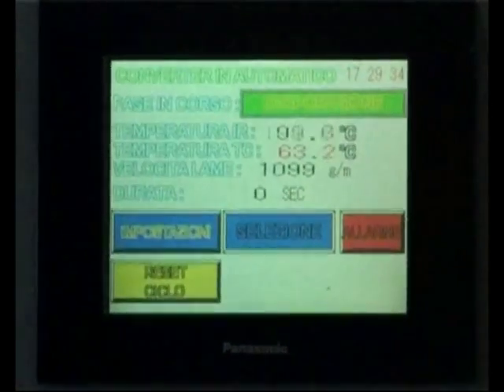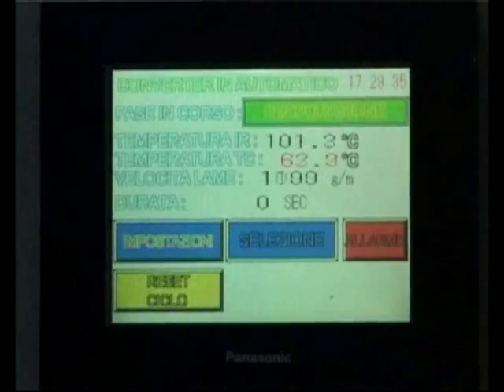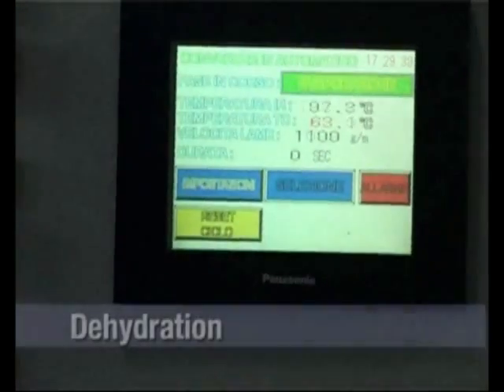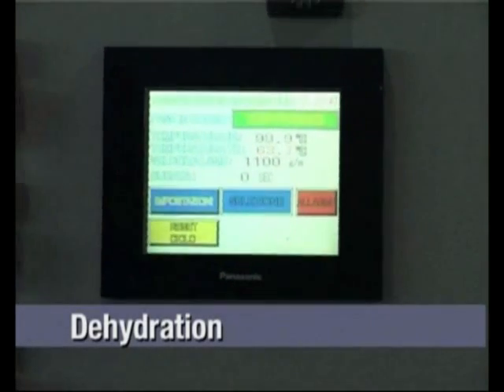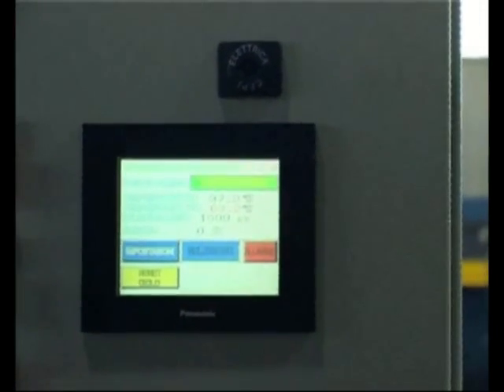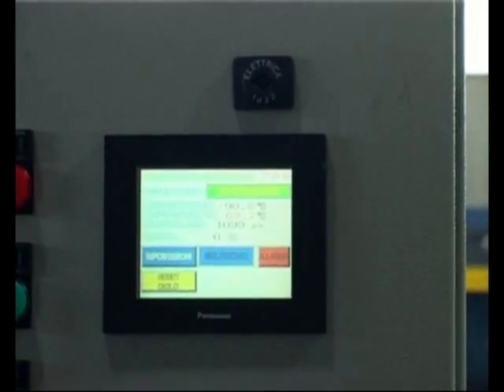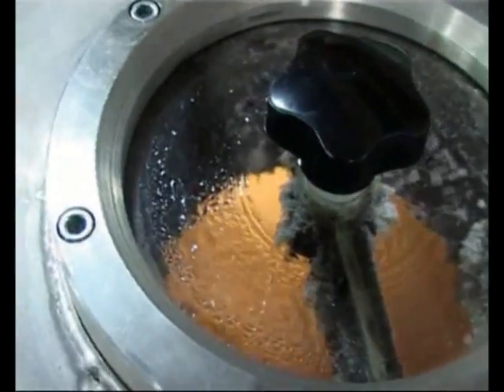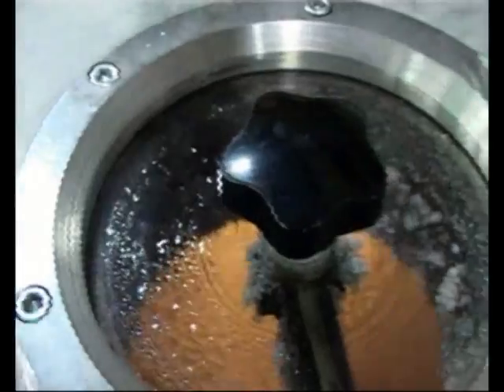At the end of the mincing phase, the blades increase in speed up to 1400 turns per minute. The display shows the temperature reaching 100 degrees through complete dehydration of the product. By removing water, the starting weight of the product is reduced by about 30%.